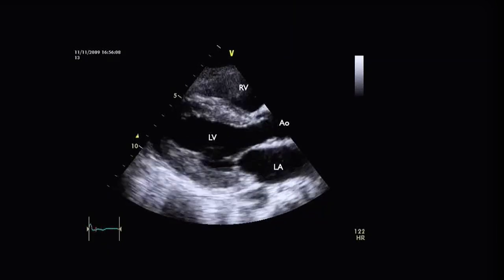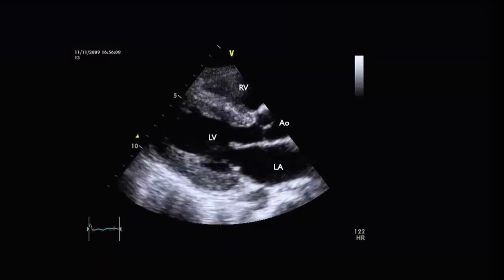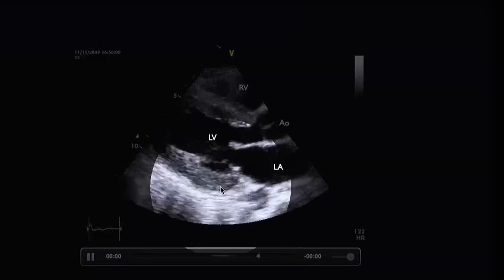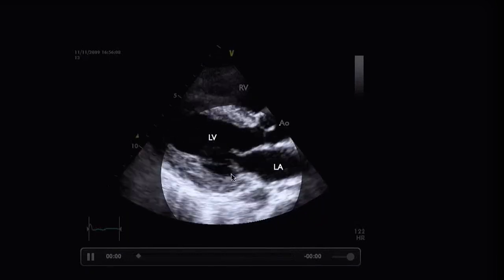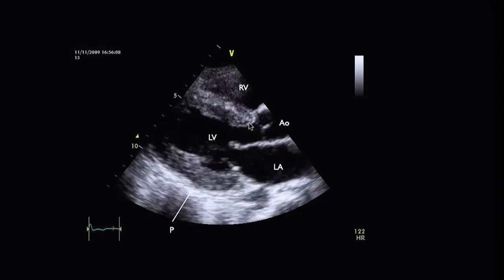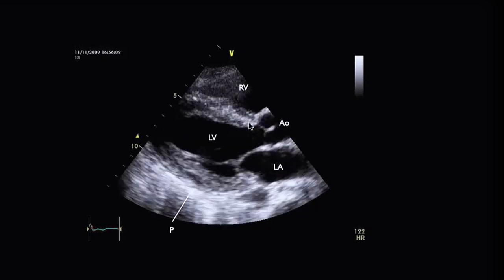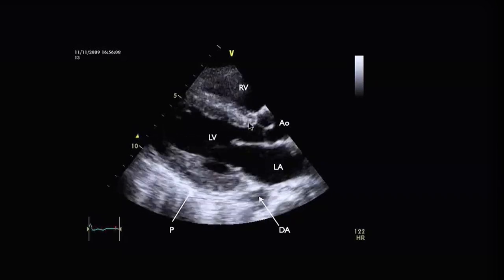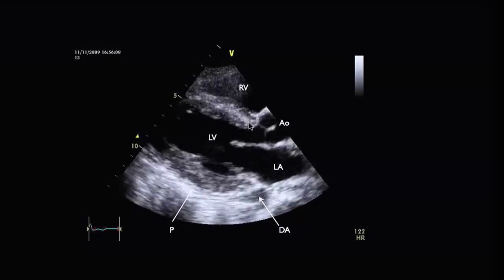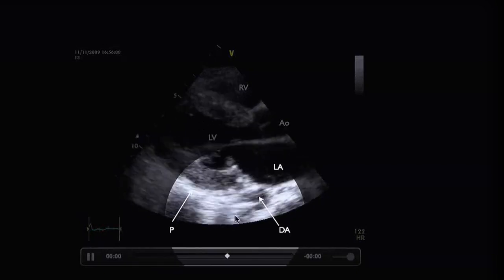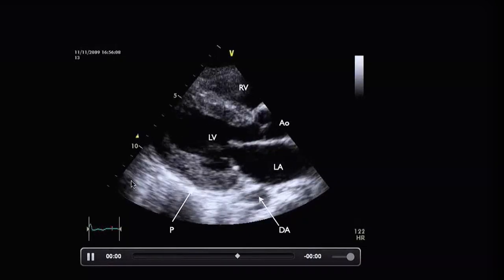This is a parasternal long axis view annotated with different chambers. We can see the left ventricle and the right ventricle separated by the interventricular septum. This is the posterior free wall, the mitral valve with its long anterior leaflets and short posterior leaflets, the aortic valve, and the aortic root. We can also see the bright pericardium running behind the posterior free wall with a tiny echo-free space containing a little fluid. Here is the descending aorta in short axis — the pericardial space stops just above it, which lets us differentiate pericardial fluid from pleural fluid.